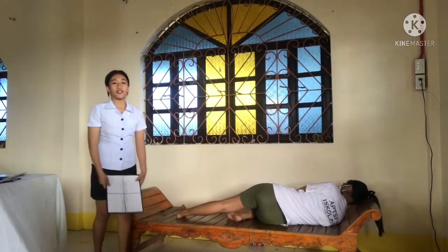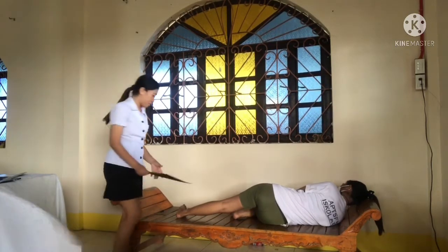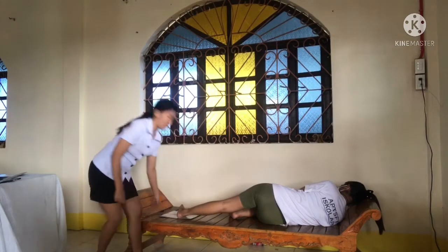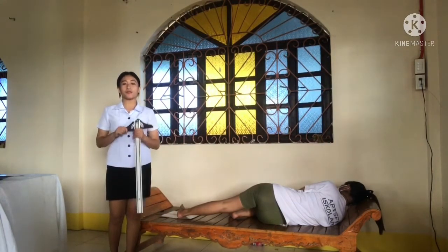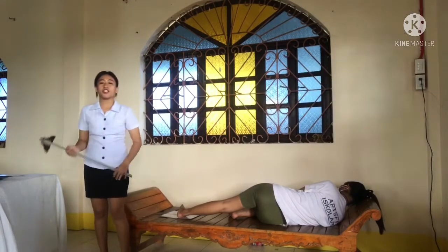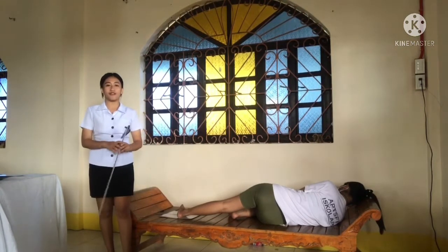So, center the IR to the middle area of the foot and adjust it so that the long axis is parallel to the long axis of the foot. So, the central ray is perpendicular to the base of the third metatarsal. So, this shows a true lateromedial projection of the foot, ankle joint, and distal ends of the tibia and fibula.